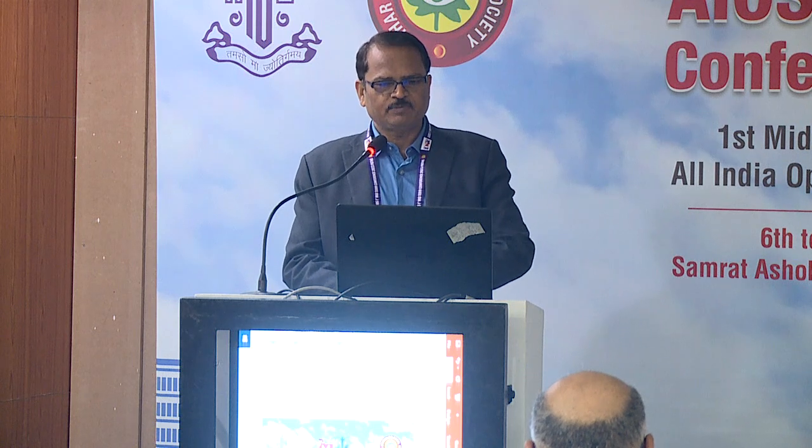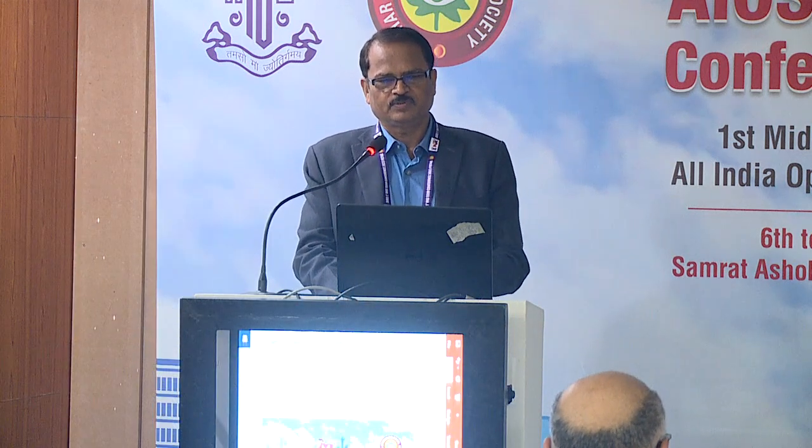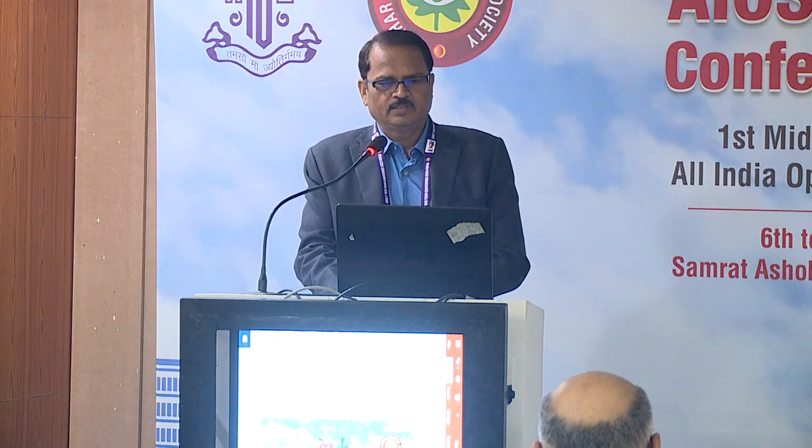This is one of the slide pictures of post-traumatic cataract. You can see there is just a big tear in the posterior capsule in this post-traumatic eye. This is posterior lenticonus, known to have PCR during the surgery. This is a case of post-intravitreal injection with PC defect.